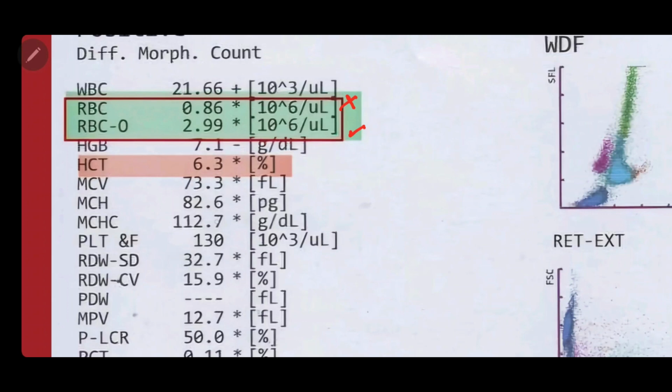These cases have a very high MCHC. When MCHC is very high, it leads to red blood cell fragmentation. When this happens, machines that use impedance for counting will have significant errors. What should you do if you do not have RBCO?